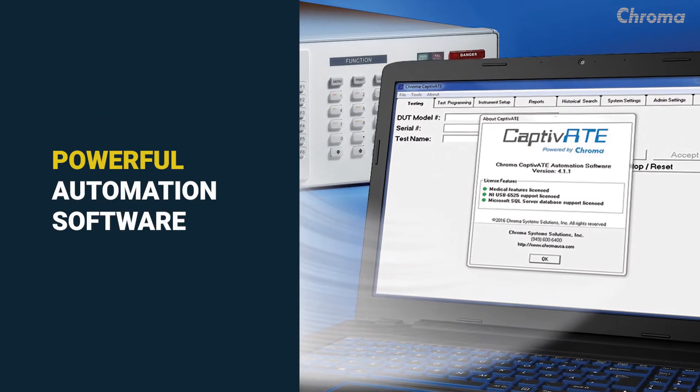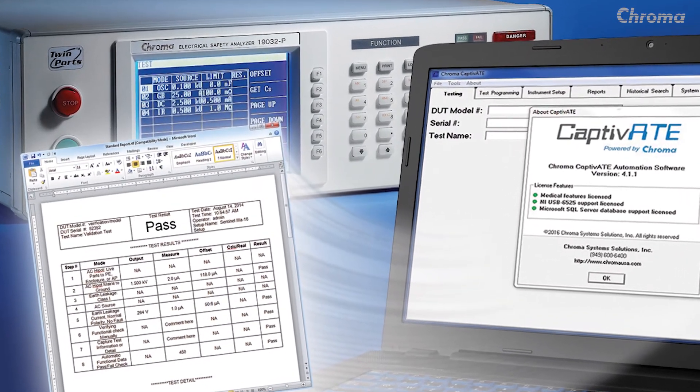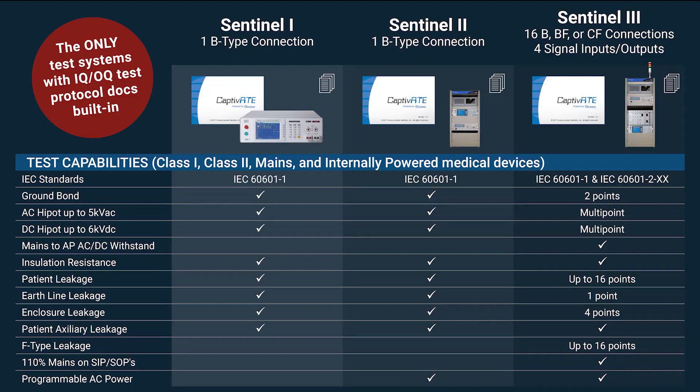Captivate software simplifies testing by accurately automating all testing and outputting all test results including IQOQ documentation. All systems include tests for ground bond, AC and DC high pot, insulation resistance, and leakage measurements.